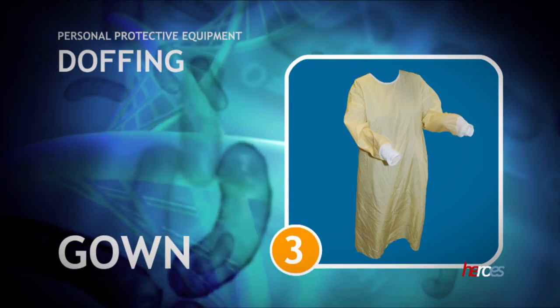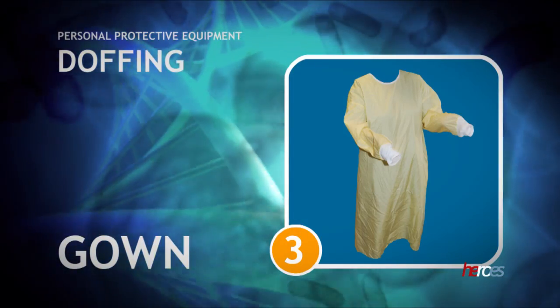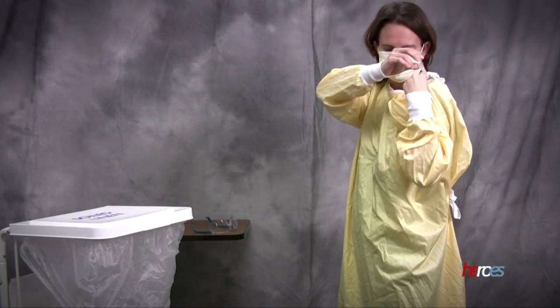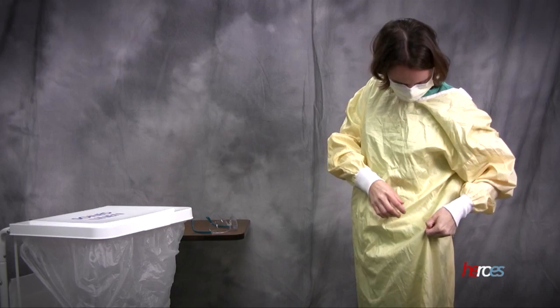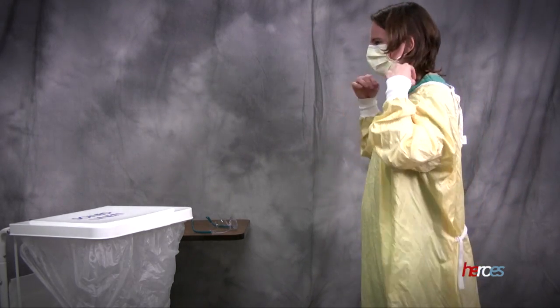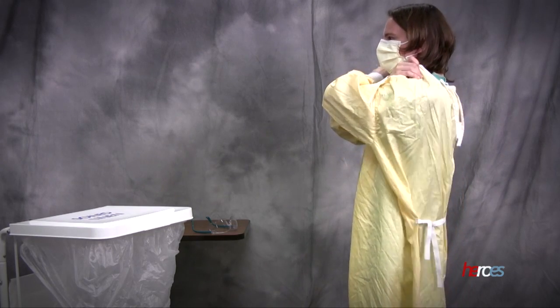The third item to be removed is the gown. The most contaminated areas of the gown are the front and sleeves. Unfasten the ties at the neck and waist, then remove the gown by slowly pulling it down and rolling it away from the body with the clean side out to form a bundle.